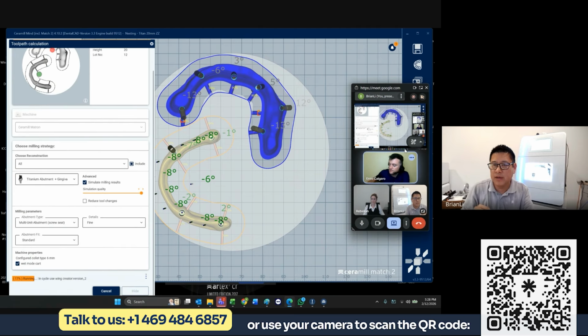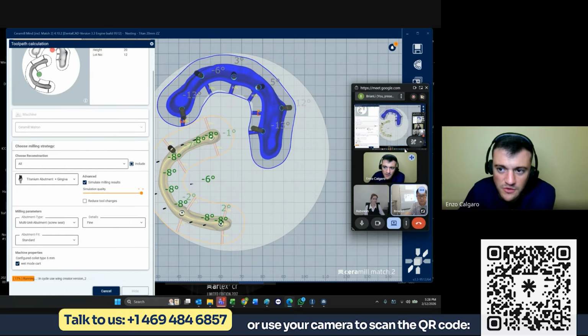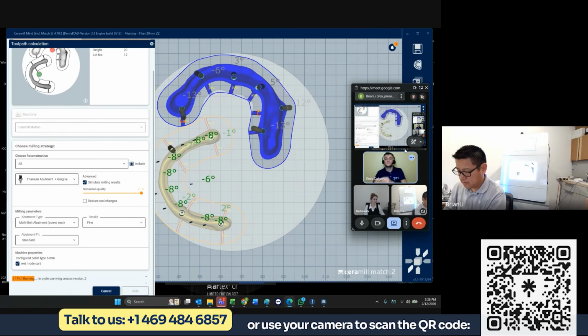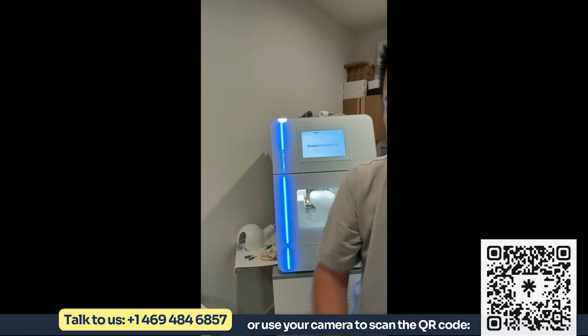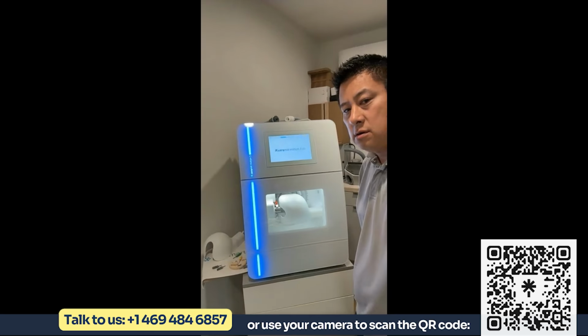Perfect. All right, so for the mill, do you think I should switch to the other camera, or do you think this one's okay? Yeah, I think switch to the other camera in case you want to show the mill. Then you're at least on your cell phone already. Okay. Now, is this better or is this better? I think this one looks good.